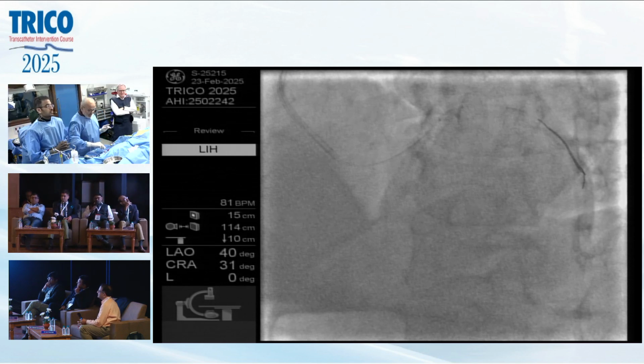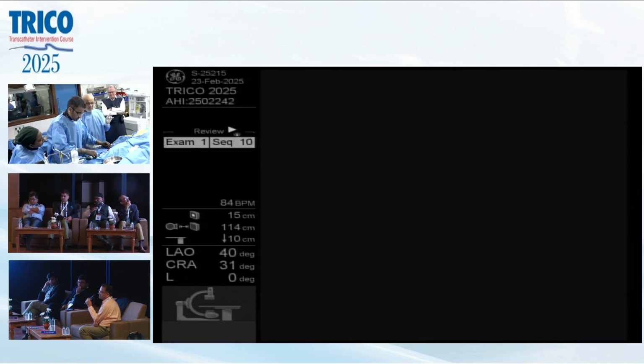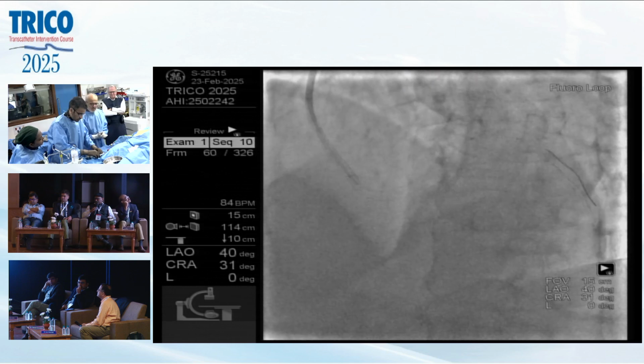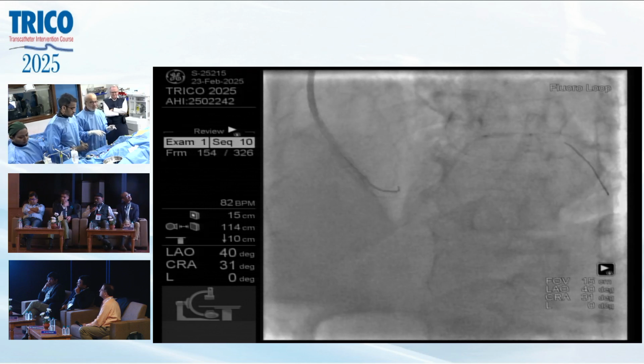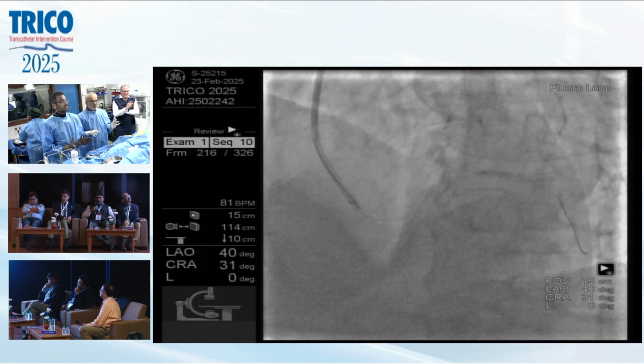Samir, what do you think? Yeah, that is a concern. And also air embolization is more common with 5 French PCI. Yep. For all the new guys, one must remember that if you are using 5 French, at every single stage you open up the cork and allow a generous back bleed to happen every time, because it sucks in air.